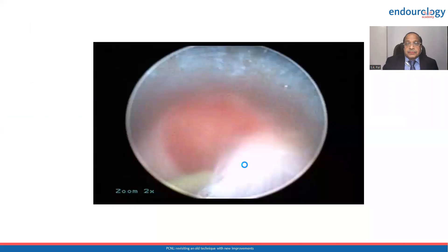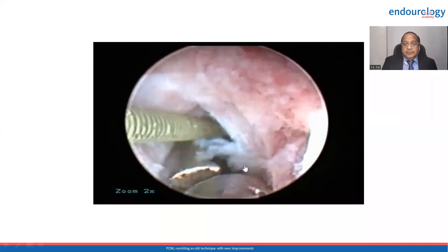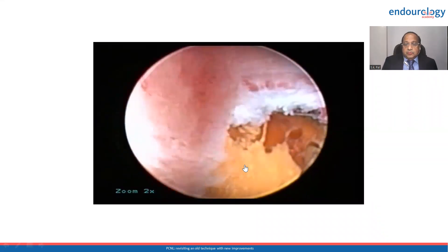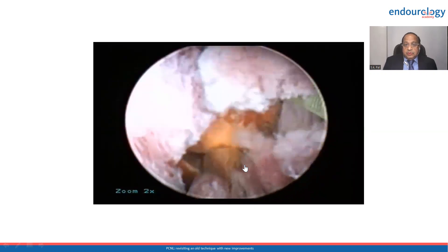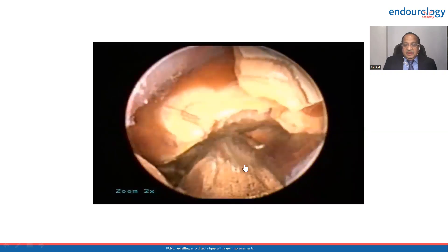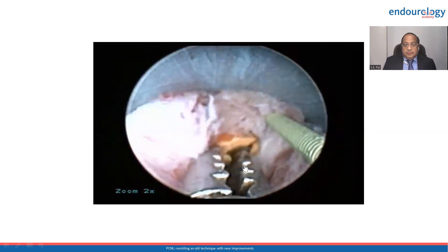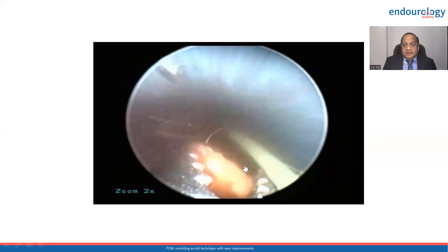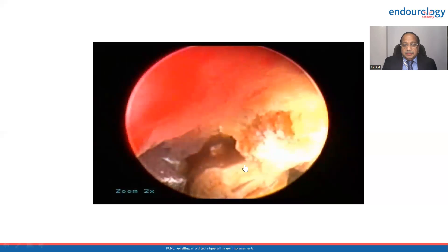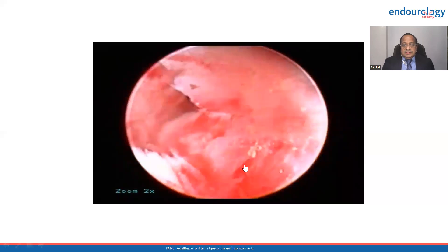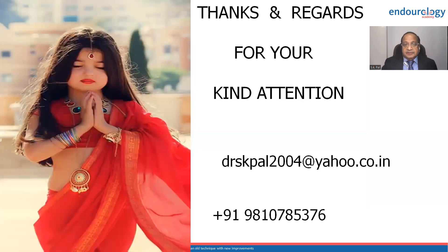For fragmentation, use a device that breaks the stone and simultaneously allows you to remove the fragments, creating space so you can push the access sheath inside. When the access sheath is still in the renal parenchyma and you cannot gain entry up to the stone, use the pneumatic lithotripsy device standing in the renal parenchyma with good irrigation so fragments come out by picking up or with irrigation. As they come out, space is created, and only when sufficient space is created can you push your access sheath through the renal parenchyma to gain entry into the pelvicalyceal system. This is how you manage a stone completely filling the system with no dilated space available.